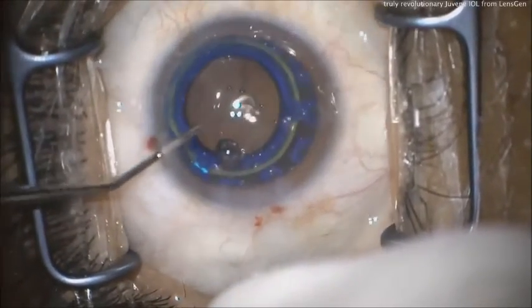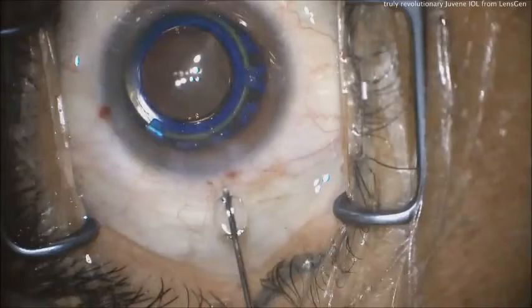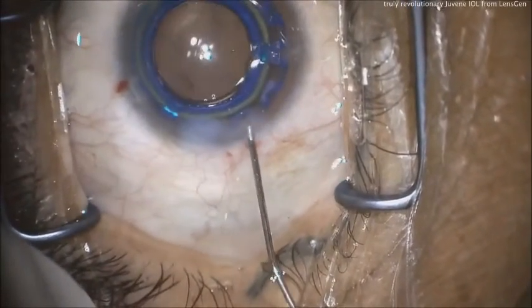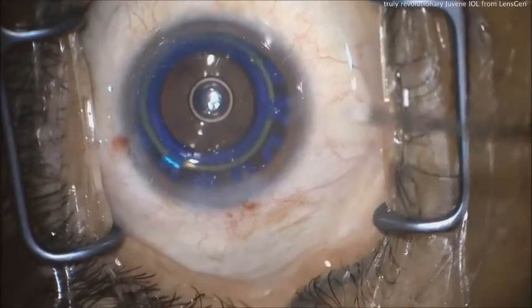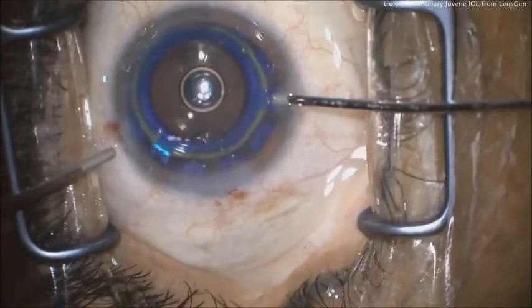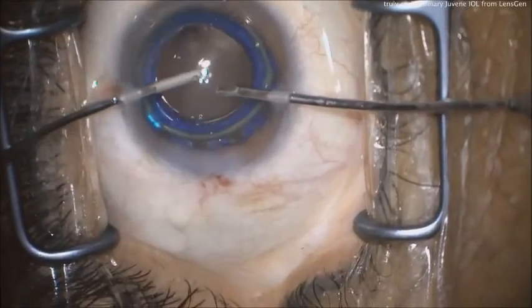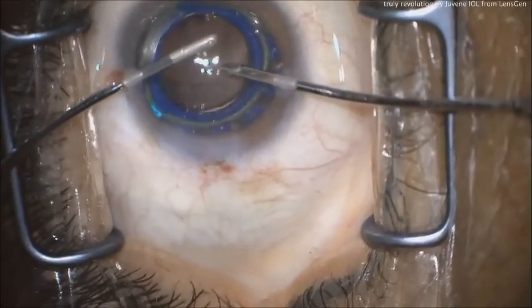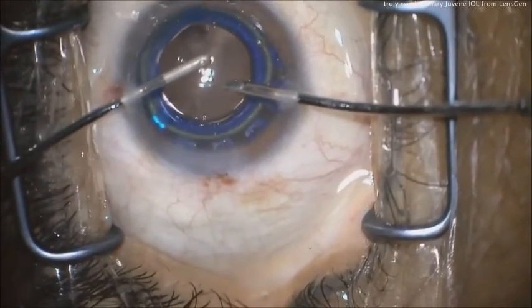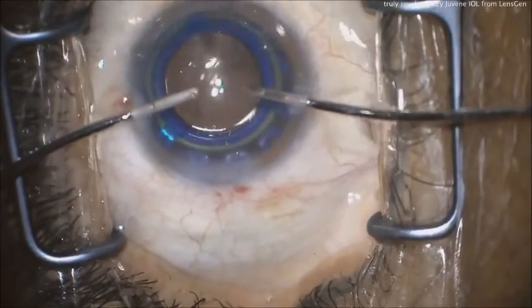From here on out, just a routine case — take out all the viscoelastic. I'm doing a bimanual IA to get all the viscoelastic out. Seal the incision, still sutureless, and everything else is normal. Very straightforward for any technically advanced surgeon. You can't really go behind the IOL to remove viscoelastic, so you do as best you can. The base lens does have fenestration windows, so you can put the IA probe through those and remove most of the viscoelastic. Any little viscoelastic that remains is no big deal — it will be washed out naturally.